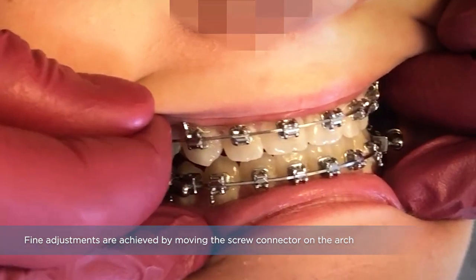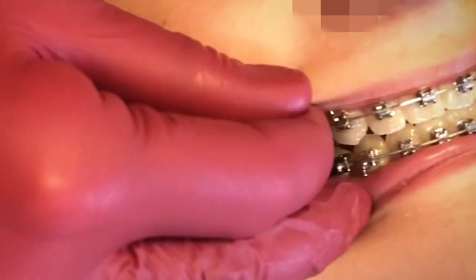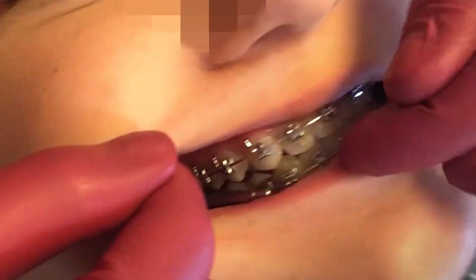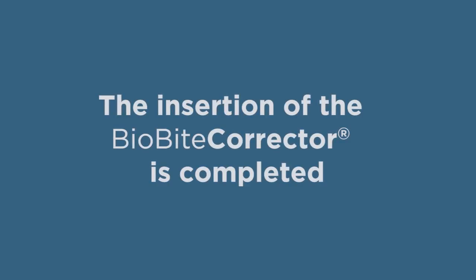The fine adjustments are achieved by moving the screw connector on the arch. The insertion of the BioByte Corrector is completed. Thank you very much for your attention.